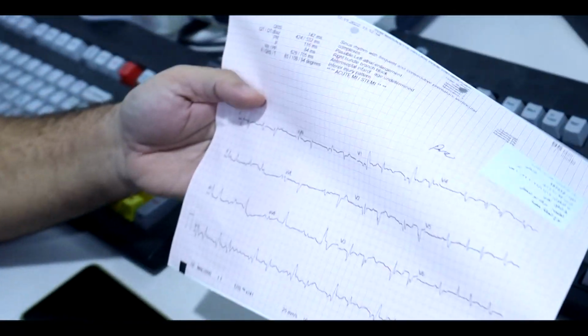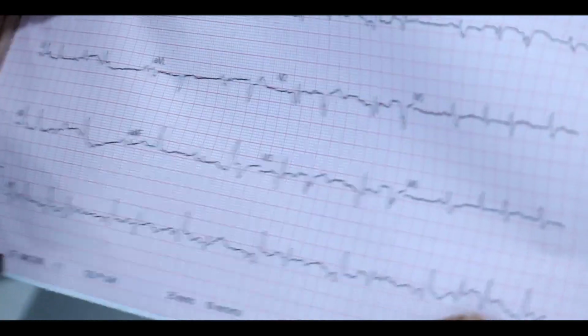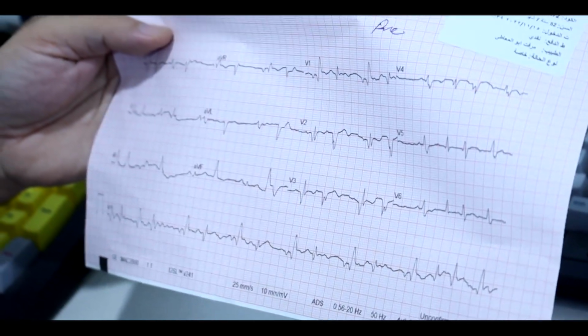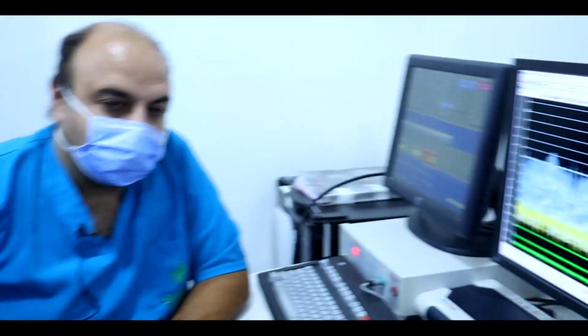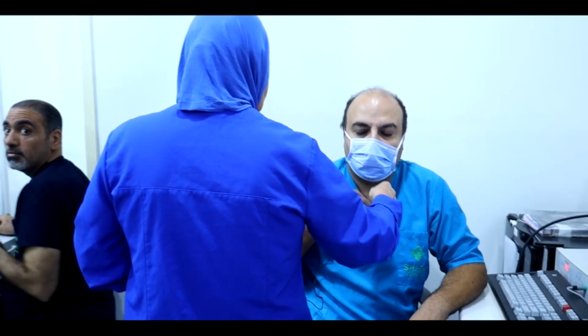This is another ECG of the same patient when he is firing in bigeminal, and running 3 beats of non-sustained VT. So the best solution was not to implant an ICD, but to ablate it. And we succeeded in the first session, and it came back. So we decided to give him another session with more extensive ablation, as Anwar will now explain what they did.